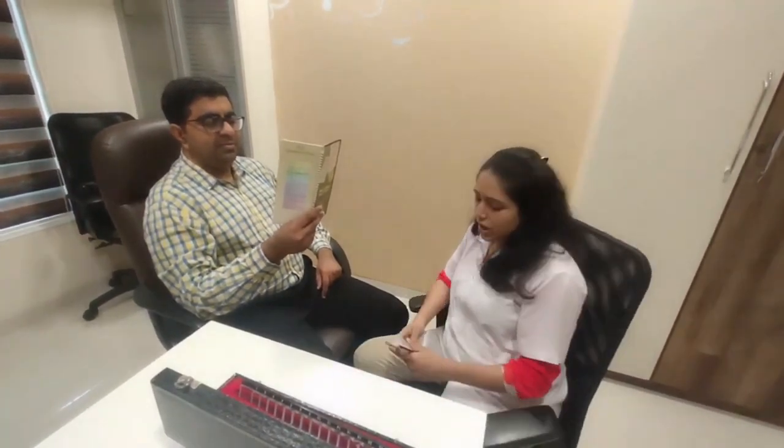To confirm the diagnosis further, whether the patient has convergence insufficiency or not, we are going to do the Vergence amplitude test, which is the negative fusional Vergence and the positive fusional Vergence, and also measure the AC/A ratio, which will give us a clear indication whether the patient has an accommodative convergence insufficiency, an accommodative insufficiency, or a convergence insufficiency. Let's begin with the test for near first.